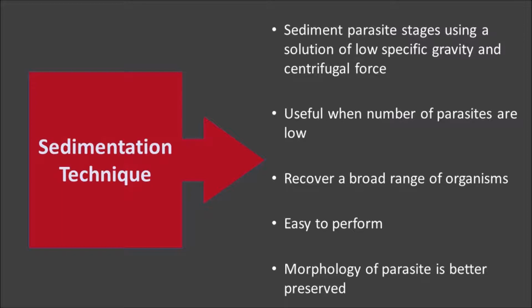Sedimentation techniques can be performed in any laboratory because they are easy to perform and less prone to technical errors. Another advantage is that sedimentation procedures can be done with fecal specimens preserved in formalin or other preservative. So the morphology of the parasite is better preserved.